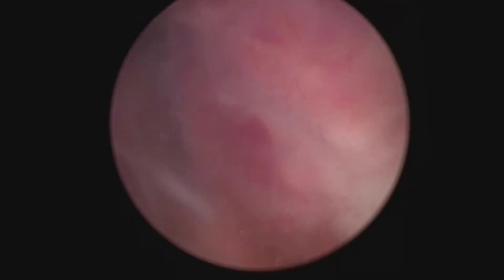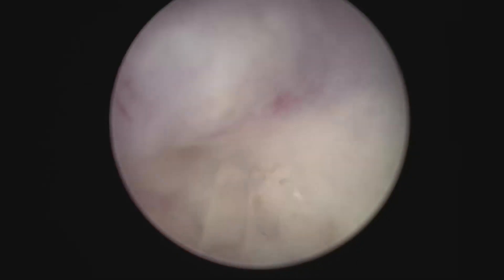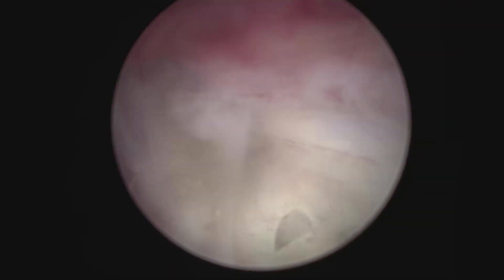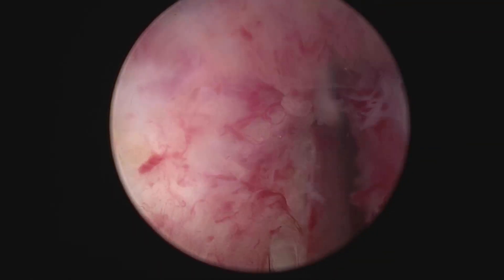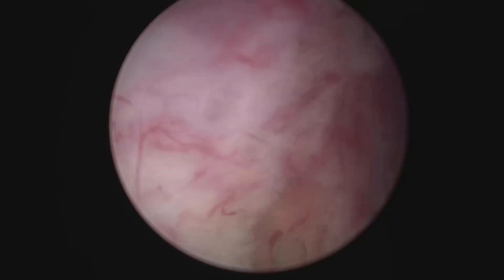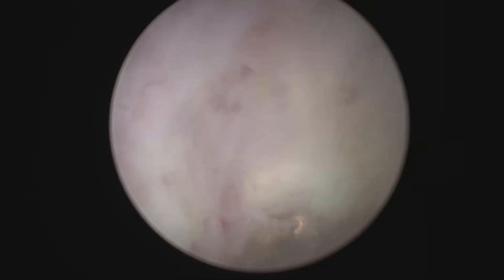There you can see the sphincter. I tried to mark the mucosa and create this line, what I call a white line, in intimate contact with the sphincter edge. I don't like to go inwards, I don't like to go some millimeters inside because this is where you have to detach the sphincter, right at the edge. As you can see, this is an asymmetrical apex, so in one side there is more bulk than in the other side. But I try to stay close to the sphincter and delineate this white line, which is going to serve as a reference for the rest of the procedure.